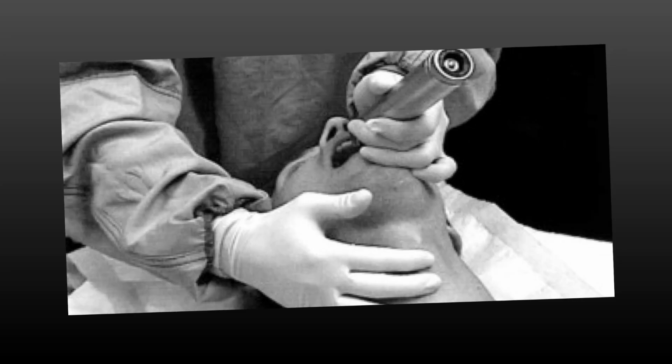When you perform all of these maneuvers appropriately and you're still unable to visualize glottic structures to your liking, the next move is to perform bimanual laryngoscopy or external laryngeal manipulation, ELM. You may have heard of this previously described as BURP, back up and to the right. However, we want to reframe that terminology to external laryngeal manipulation because although commonly you are manipulating the larynx back towards you and to the right, sometimes it's a different direction that's going to bring that glottis into view.